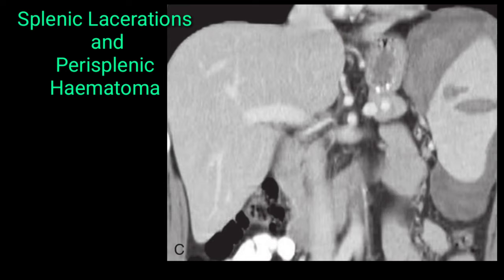This CT scan image confirms the previous case. Within the spleen you can see a hypodense oval area within the splenic parenchyma, along with another round lesion. This confirms intra-splenic laceration surrounded by perisplenic hematoma — a well-defined hypodense area surrounding the splenic capsule representing perisplenic hematoma and splenic laceration.